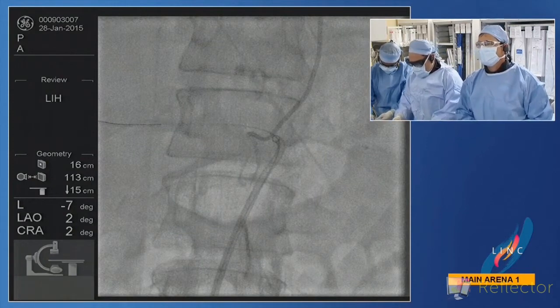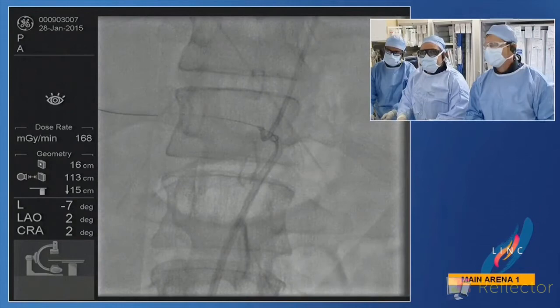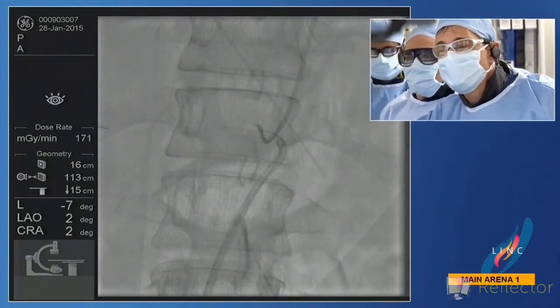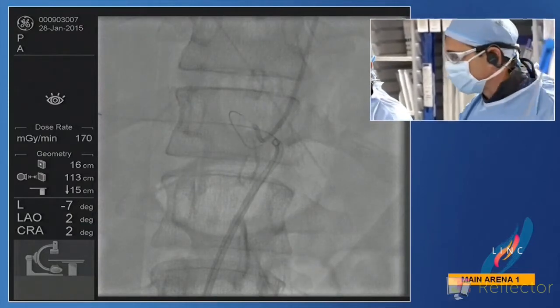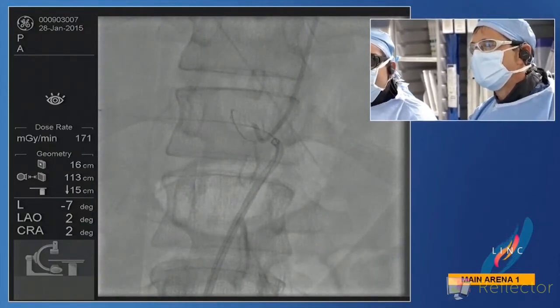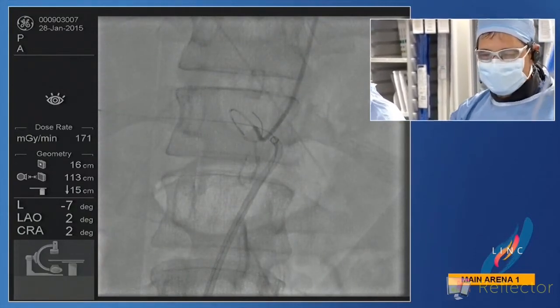Left gastric, I'm more worried about backwards filling. Again, we have experience prophylactically embolizing left gastric, and very interestingly, in the bariatric setting now, there's an interest in doing this to reduce the production of ghrelin and cause early satiety. So including that doesn't worry me so much. I'm a little worried about the size mismatch, though, as we get to that common hepatic. As far as the ostium, I think you may be right.